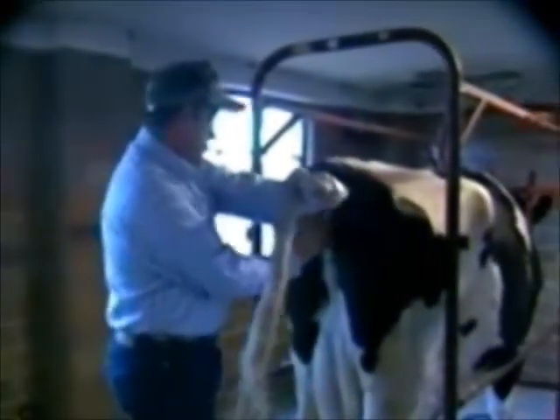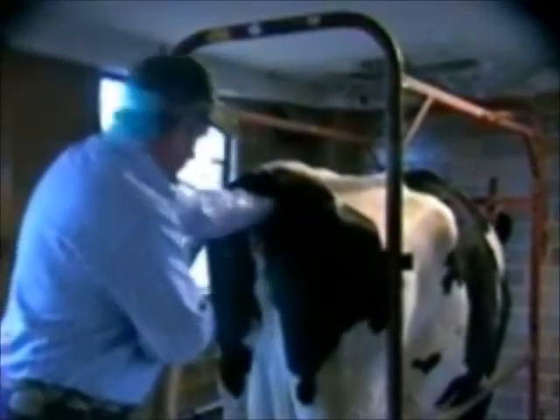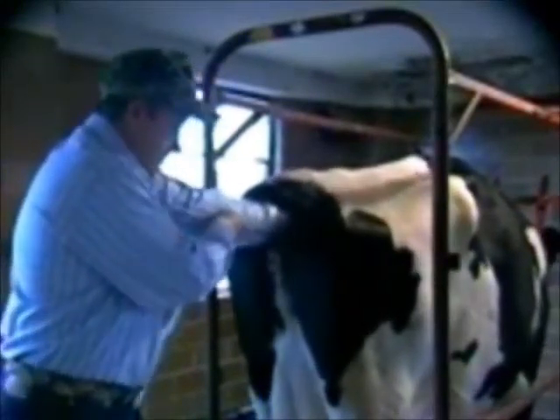To AI the animal, we lube up our hand and go in and clean the vulva area where we're going to insert the rod. The hand can then be placed into the rectum, and as will be shown here, by gently pulling back on the rectum as he inserts his hand, he can actually open up the vulva — then cleanly putting the rod into the vulva and into the vagina.